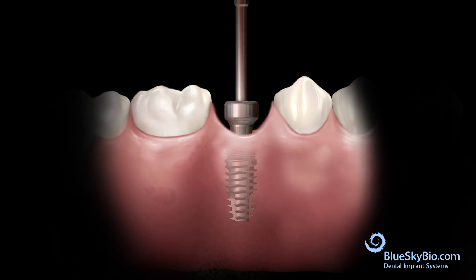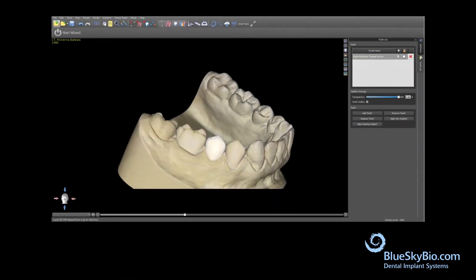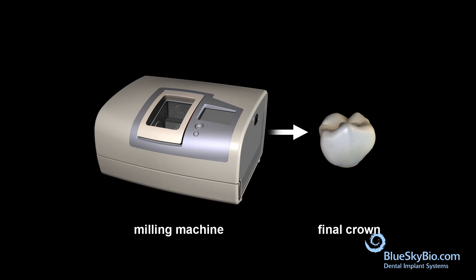Replace the healing abutment. The restoration is then designed in a CAD-CAM program, and a self-supporting ceramic crown is manufactured.